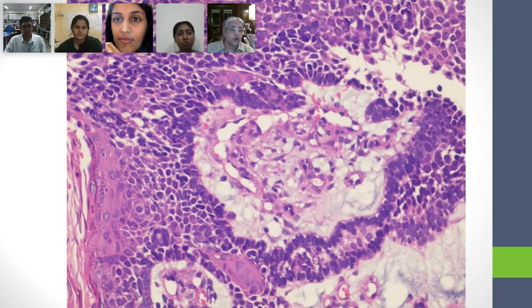On your normal basal cells, where do the nuclei lie? Basally. They are at the basement membrane. Where are these nuclei now? Away from the basement membrane. So, what kind of epithelium do you think you're looking at then? You think this is squamous epithelium?